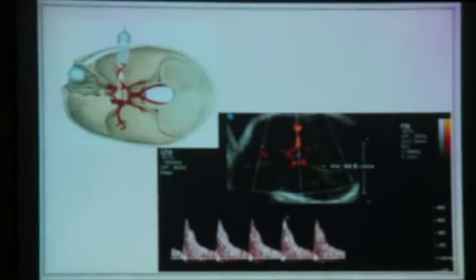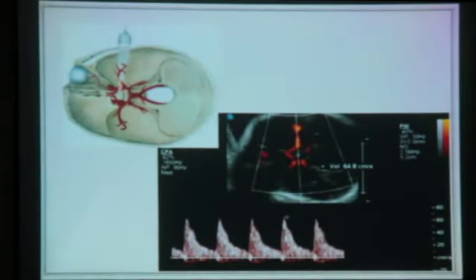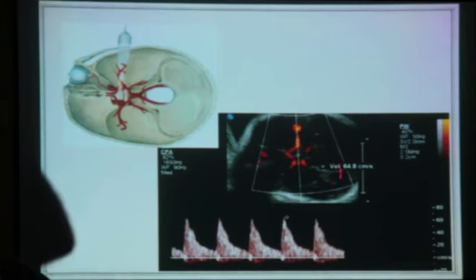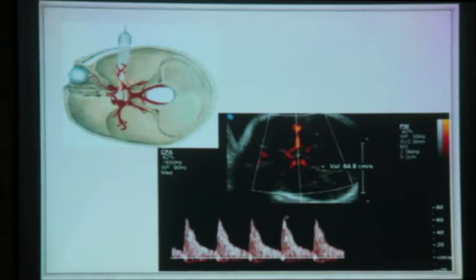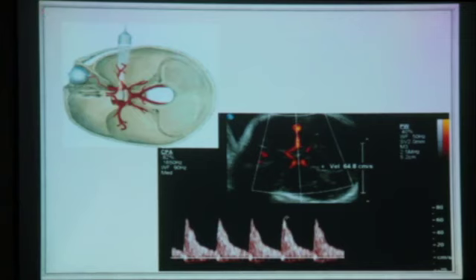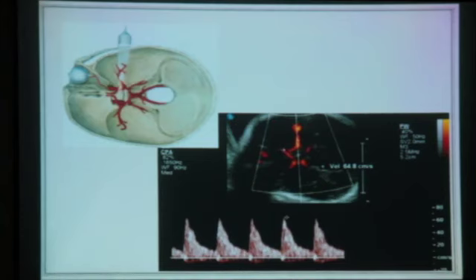On the ultrasound image, you see the skin, then brain tissue after the skull, with the opposite skull on the far side. Orient yourself: your nose is anterior, the back of the head is posterior. You can identify the middle cerebral artery, anterior cerebral artery, and posterior cerebral artery in this view. The technique was originally used without color Doppler using only depth-based pulsation detection.